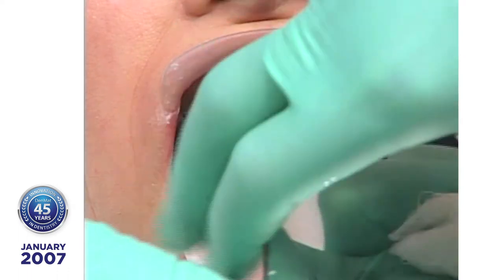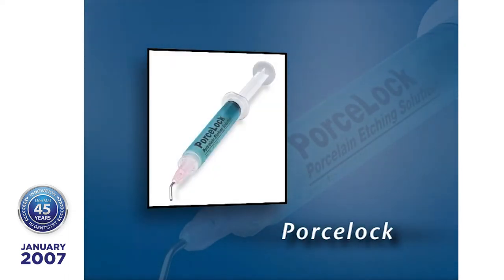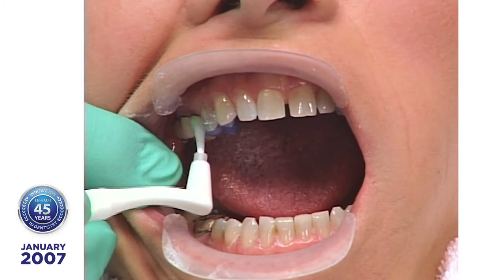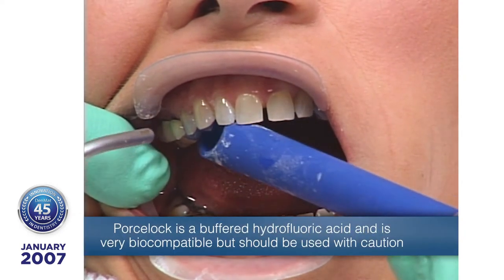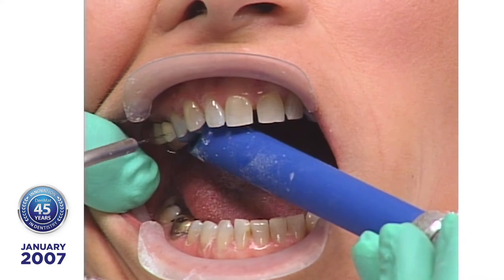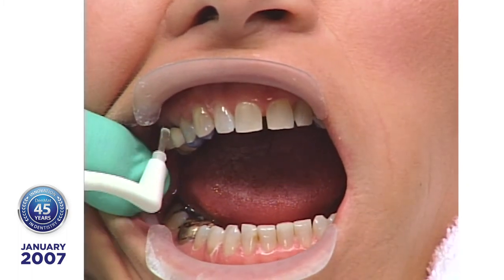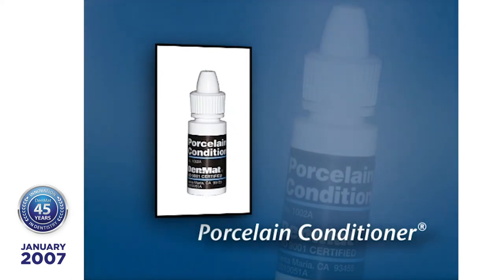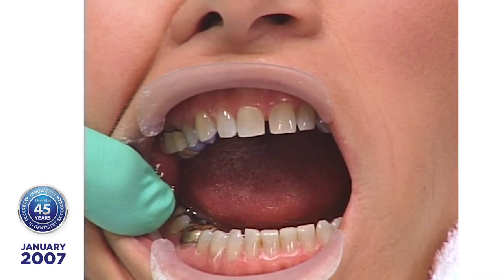Wherever we have that paint-on dental dam, when the Ultrabond goes on those prepared surfaces, it won't stick to the underside of that and it'll help clean it up very quickly. Now the first thing we're going to do is put a little Porceloc on this bicuspid — not much, just a little. Porceloc is hydrofluoric acid, about 3% buffered, and you want to be very careful using it. Then we micro-etched, put Porceloc on, and now we're putting on porcelain conditioner, which is citric acid. We put that on first before we put on Serenate Prime, which is inactive silane, and it's the organic acid that kicks it off.